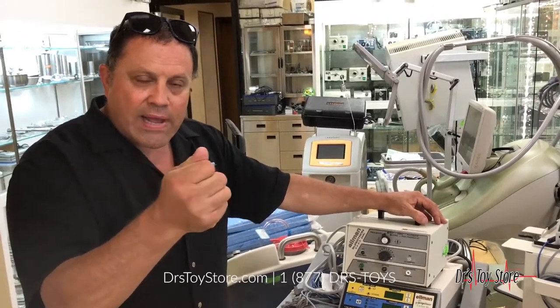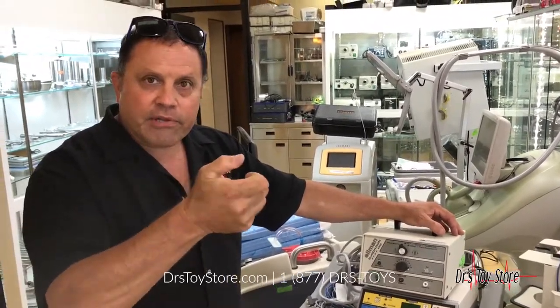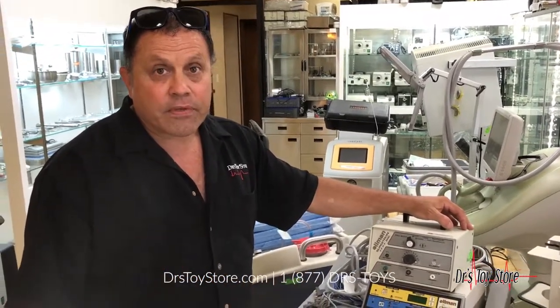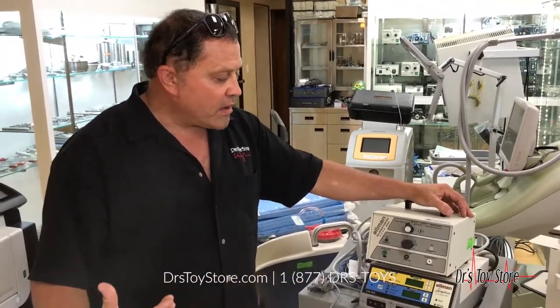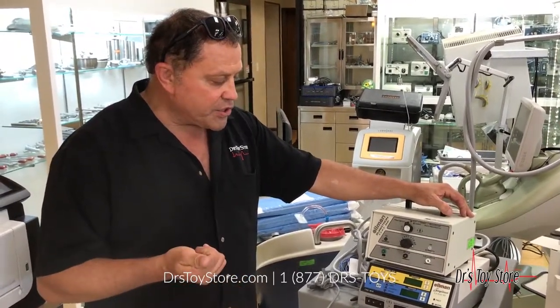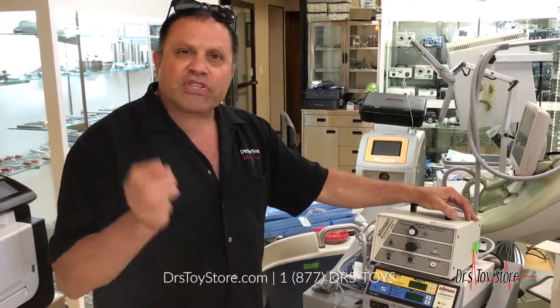When you cut and coag, you're doing damage to the tissue because you're cutting and coagging. With the RF, it's less. So that's a radio frequency unit. It also can do monopolar, bipolar. It comes with a hand switch, a ground plate, and there's several different tips.